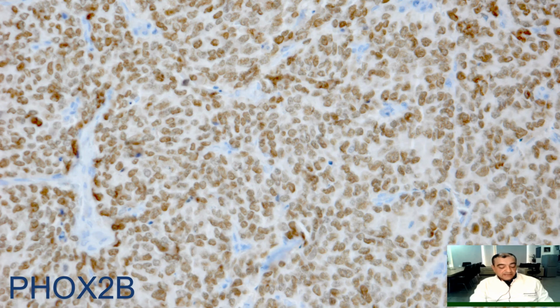It's paired-like homeobox 2B, a transcription factor located on chromosome 4 and has a crucial role in the development of the autonomic nervous system, especially those of noradrenergic origin. That is why PHOX2B highlights the tumors that come from this part of the autonomic nervous system.